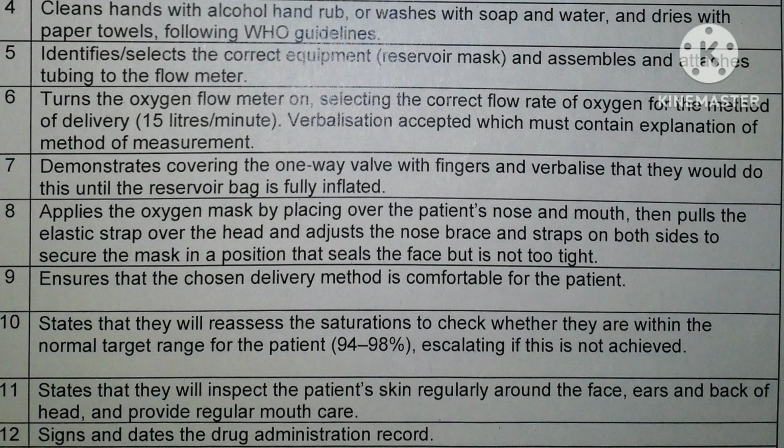Then I will check the skin around your face, nose, ear, and back of the head, and provide mouth care regularly. We should tell that one also. Then we can give some health education to them. We can tell them, as the oxygen is dry, you can drink plenty of water as per the doctor's order.